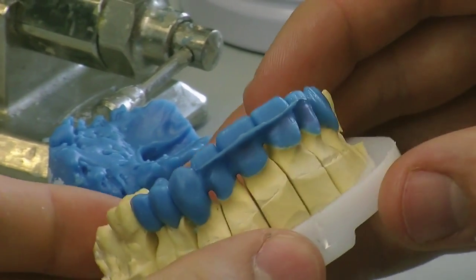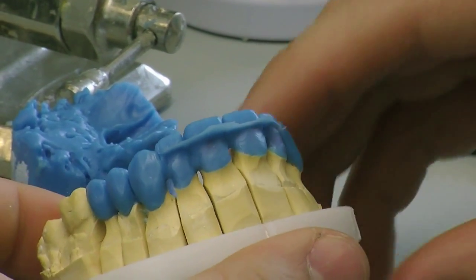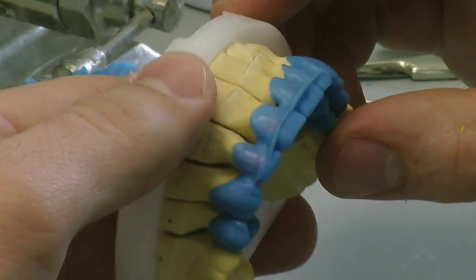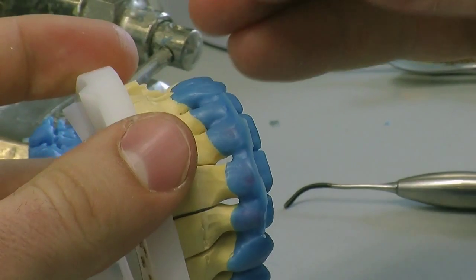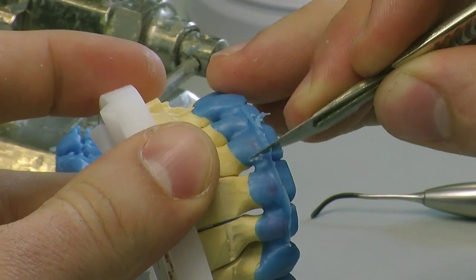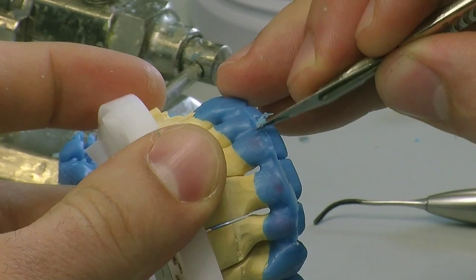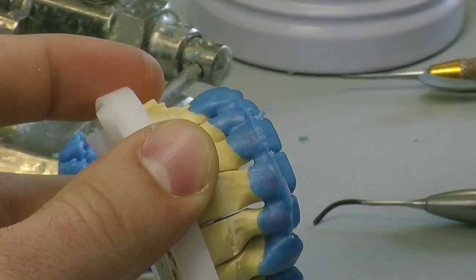There we are — we've got a perfect incisal edge position, full contour using the very accurate putty. It has palatal stops so it has a three-point contact on the arch. So now we're just going to take the flash off and the next stage is going to be adding the mesio and distal line angles and building in the rest of the wax to give it the full contour shape that we're looking for.